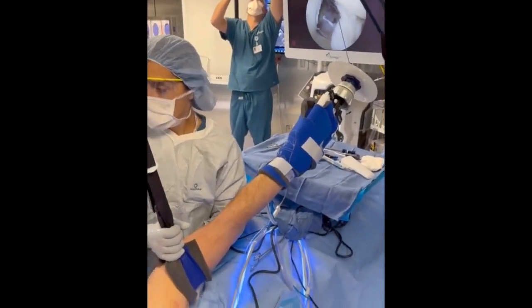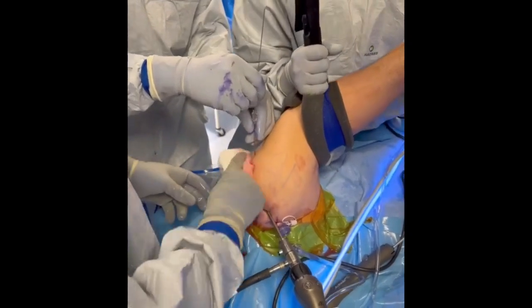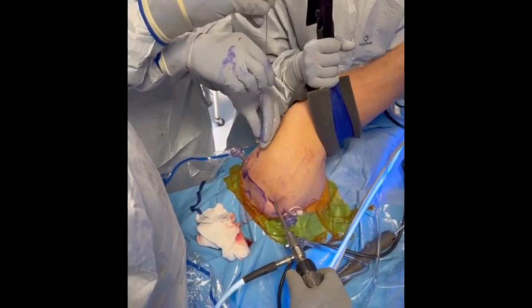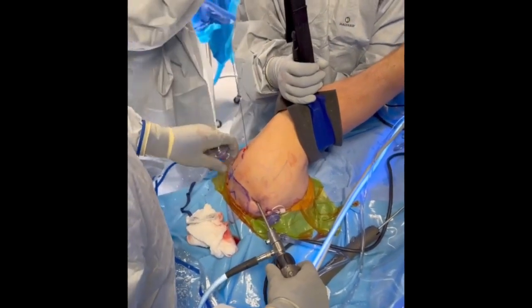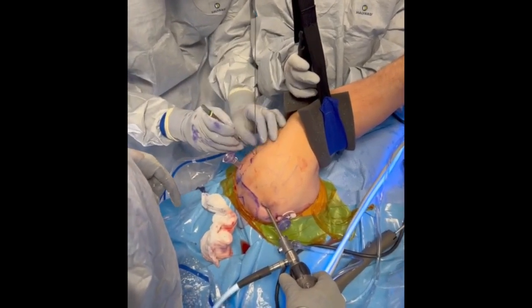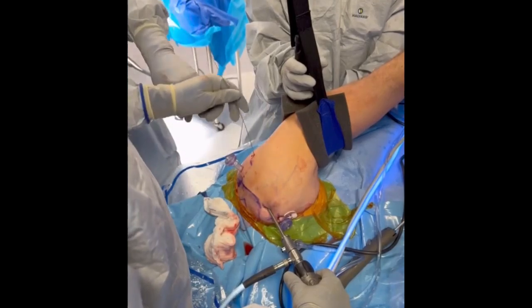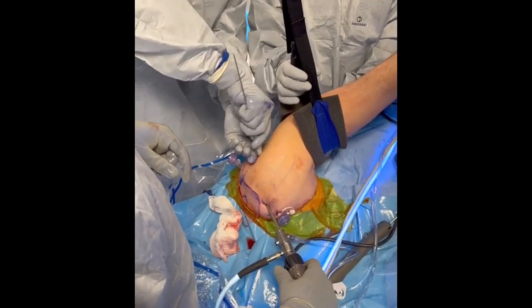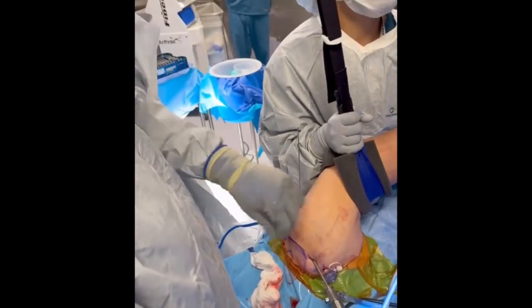Once the portal location is confirmed to be satisfactory, a nitinol wire is placed through the spinal needle and the spinal needle is removed. A small 3 mm incision is made over the nitinol wire and a cannulated switching stick is placed over the nitinol wire. The nitinol wire is removed and the drill guide for the anchor is placed over the switching stick.